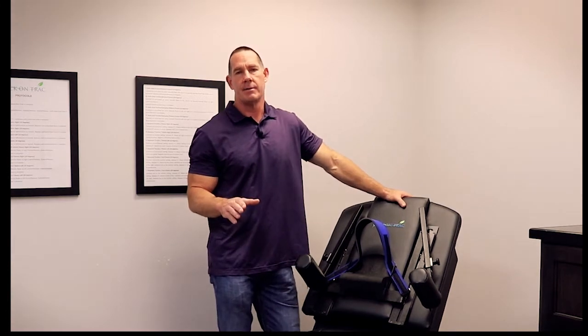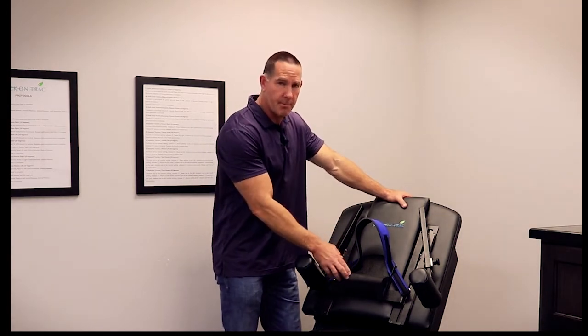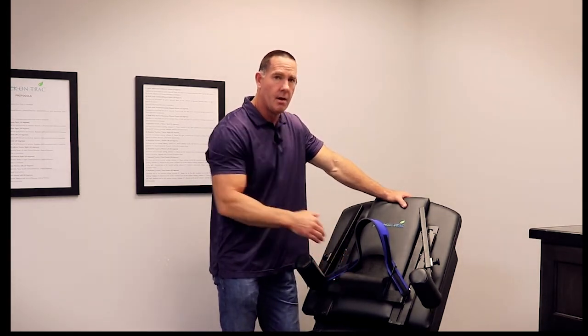We've been getting some complaints from doctors out in the market that it's very uncomfortable for the patient. And I think if we can teach you how to properly set this thing up in the proper position of the pillow, you're going to find that most of those complaints will go away.